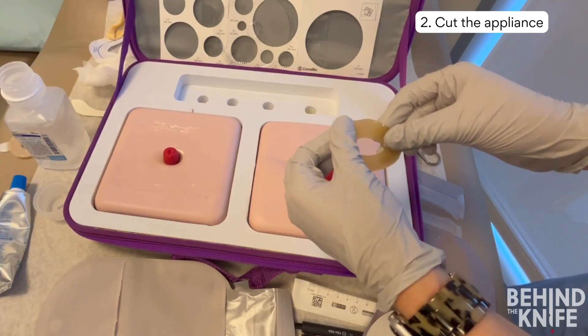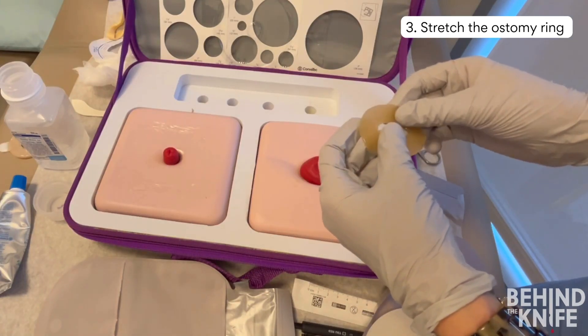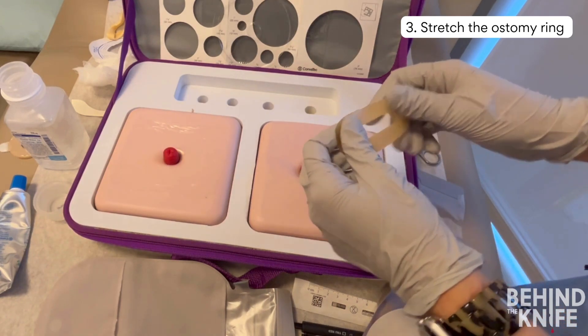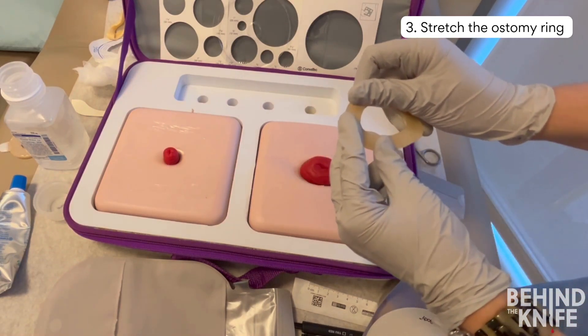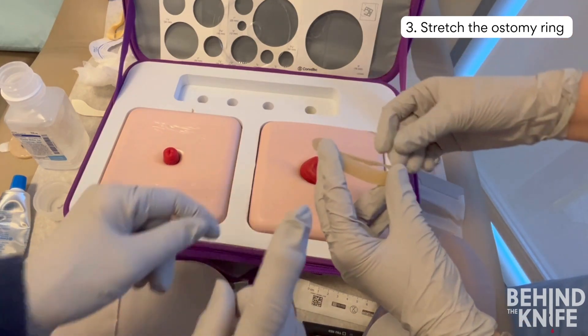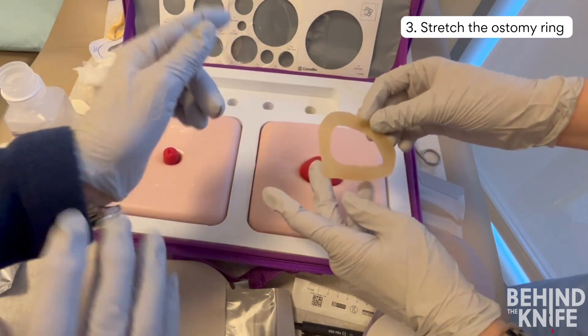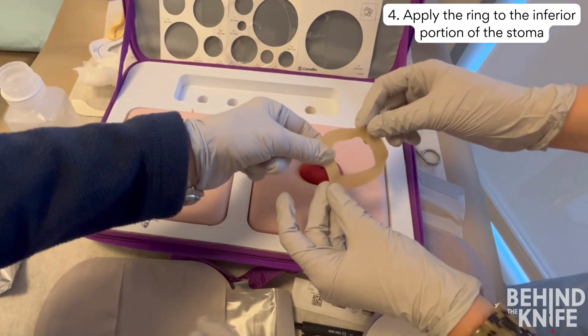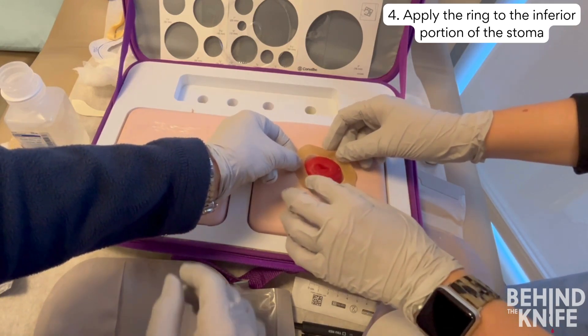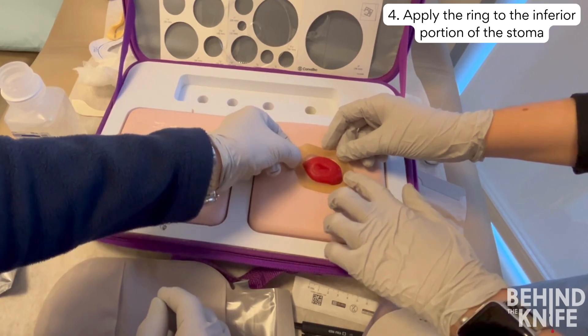To apply an ostomy ring, start by stretching it just enough to fit around the ostomy. The ostomy ring should be touching the mucosa of the bowel circumferentially. If you over-stretch the ring, don't worry — we will show you how to fix it. When applying your ring to the abdomen, start at the inferior border of the stoma, as stool runs down into the appliance and you want a tight seal in this area to protect the skin.